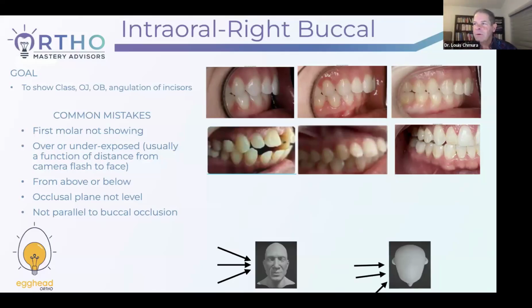I've got a couple of questions up here that I'm going to try and answer now, and then I'll come back. We take a picture with a mirror for the occlusal shot. Do we need to reverse it horizontally so tooth number 3 is not seen as tooth number 14? The answer is absolutely. Yeah, and most software, when you put them in, will automatically compensate for that. Or you can do it behind the scenes. I know that's true of orthodontic software. I assume that's true of dental software, that there are some controls behind the scenes when you put them into an array that you can say, whenever I put this one in, reverse it.